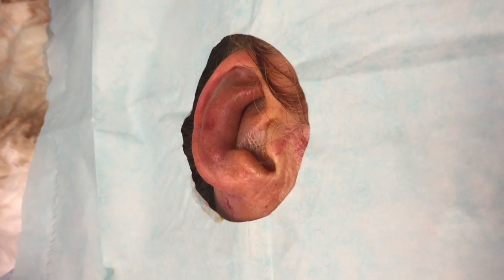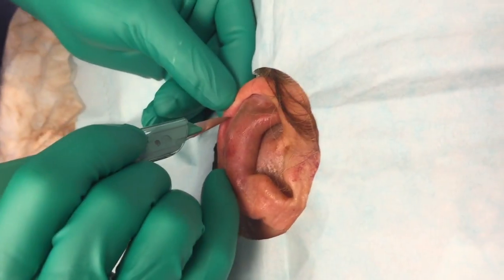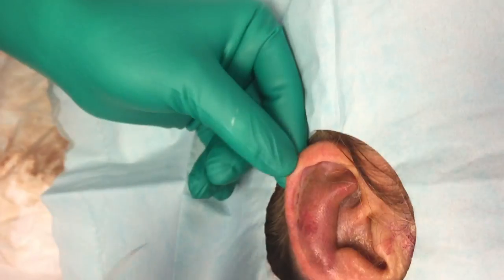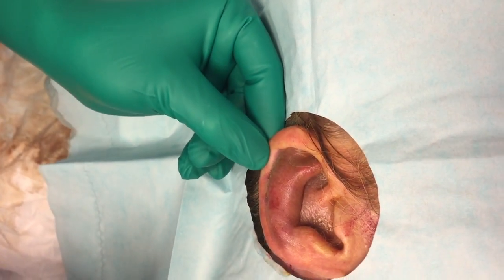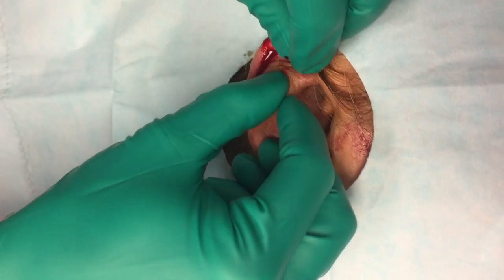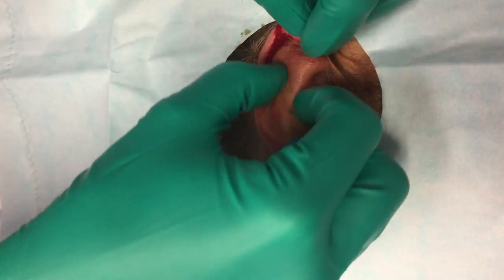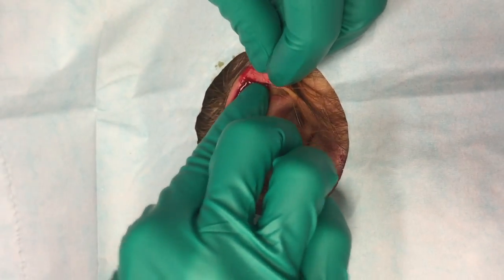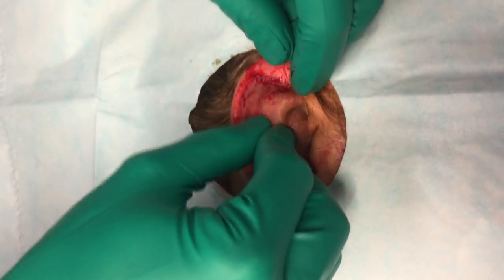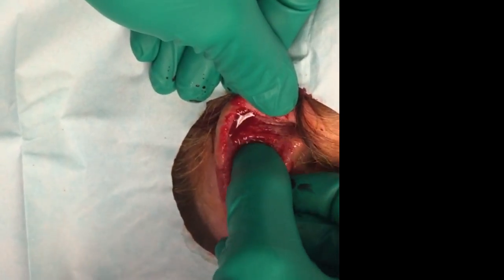After the auricular block, the ear is prepared for incision and drainage. The hematoma may be incised along the natural skin folds along the edge of the hematoma following the natural curvature of the pinna. The incision should be no greater than one centimeter. After the incision, at times, peeling the skin and perichondrium off the hematoma with blunt dissection is necessary. Other times, as seen here, manual massage of the hematoma and evacuation is sufficient.